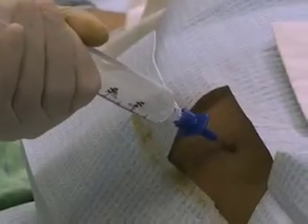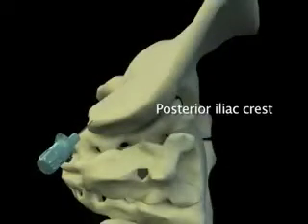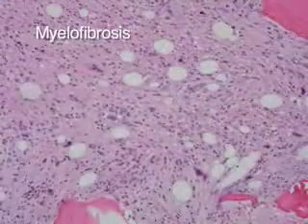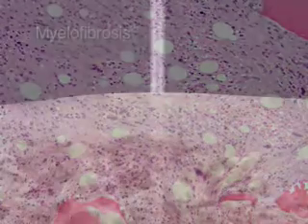Occasionally, bone marrow cannot be aspirated. A dry aspiration may be due to inadequate angle of the needle insertion. In this case, repeat needle placement should be performed. A dry tap can also be due to underlying bone marrow disease, such as myelofibrosis or certain hematologic malignancies.